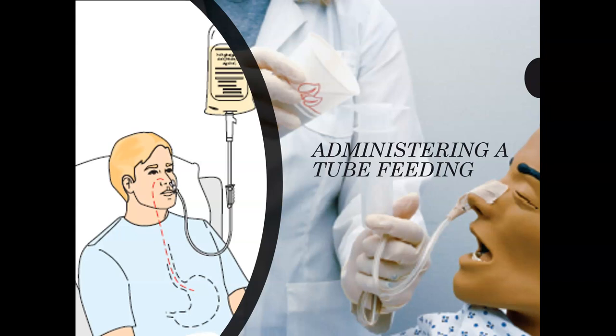Especially when they have this, we want to be very careful to check for residual, because if their body is not moving that food, those contents, throughout their intestines and out of their body, it's going to just stay in the stomach. And then if we keep filling up the stomach, it's going to fill up, fill up, fill up.